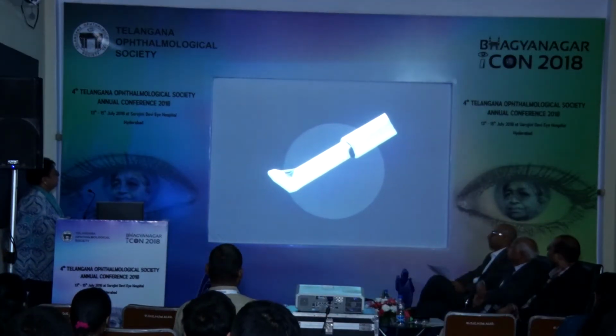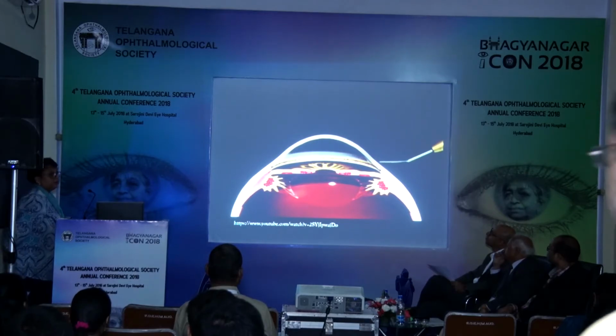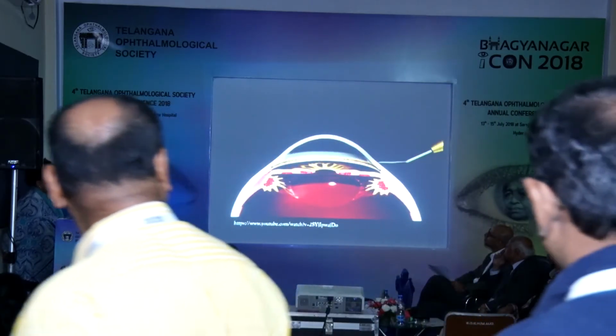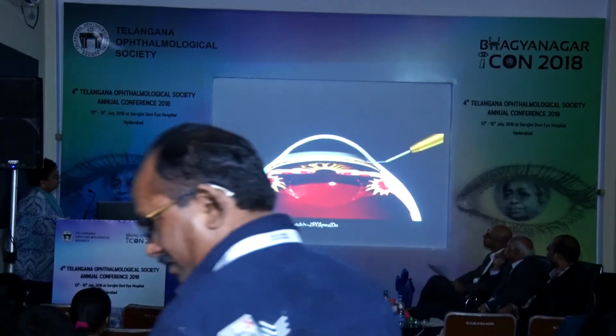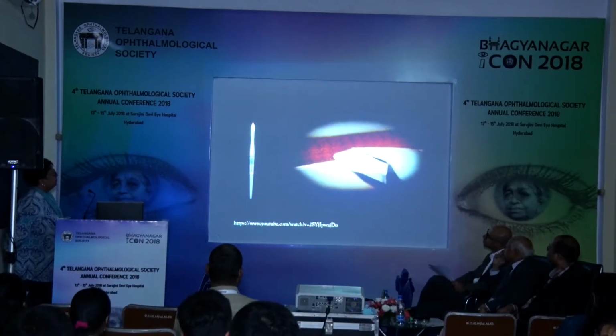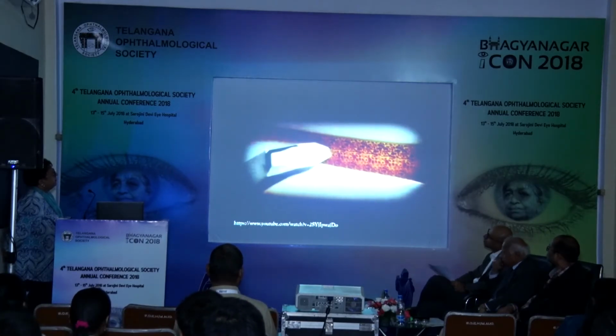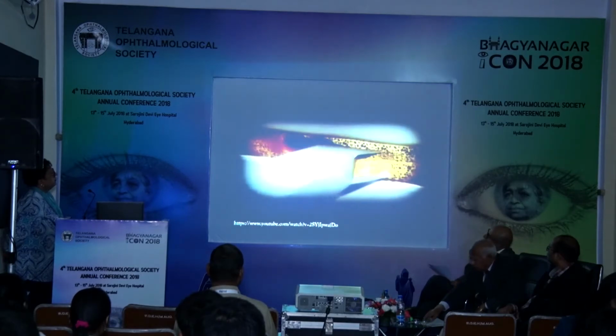Kahook Dual Blade is a single-use ophthalmic blade which utilizes an ab interno approach through a clear corneal micro-incision. Dual blades are positioned for precise parallel incisions of the trabecular meshwork with minimal residual leaflets.